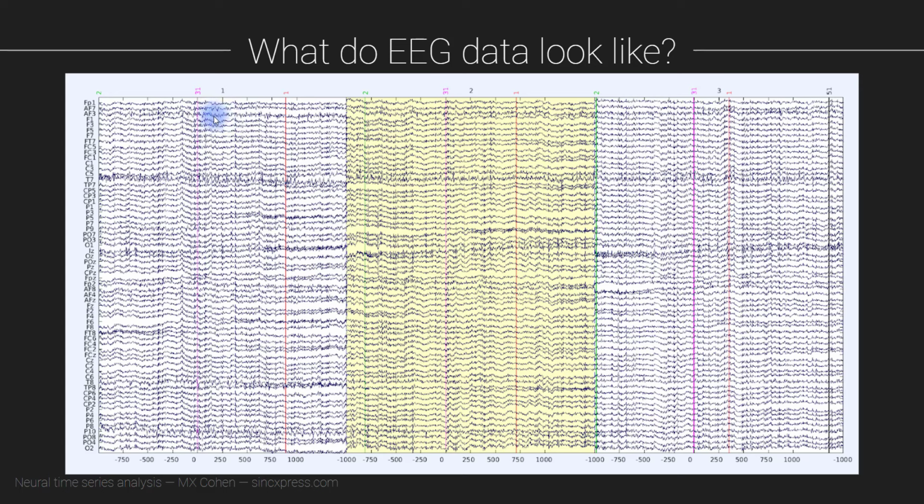So you can see that there are some striking features of EEG. There's a lot of really small deflections. Some of that is noise, some of that is high frequency activity, and then there are some slower fluctuations. You see some patterns of activity are consistent across many electrodes, and some are a little bit more local and just isolated to a single electrode. Very often with EEG, if you see unique activity on one electrode that you don't see on any other electrode, it's probably some noise contamination.